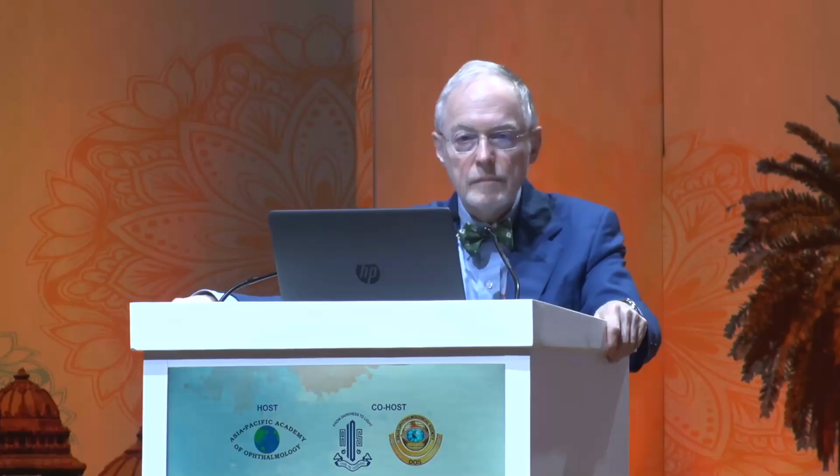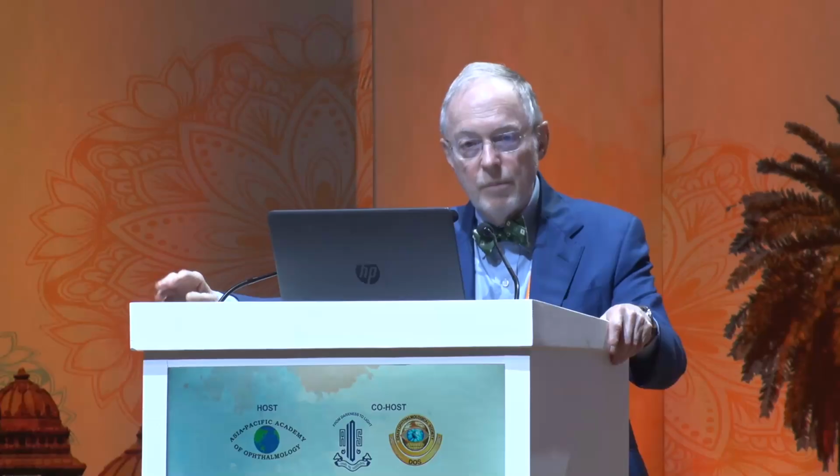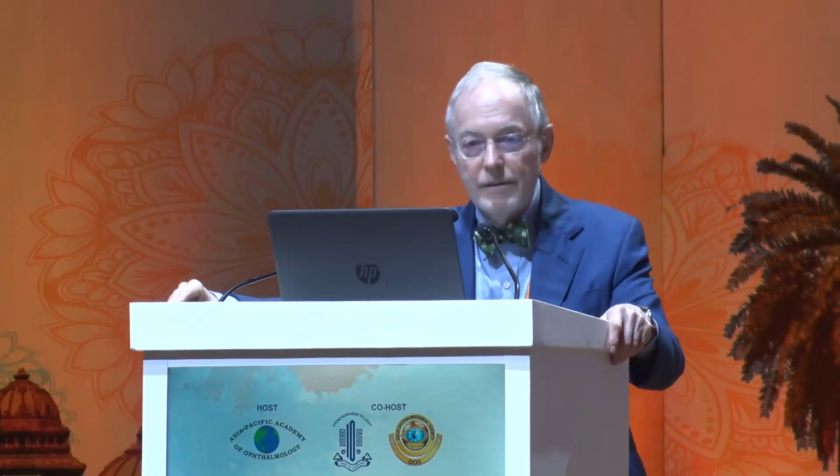What would be your recommendation for calculating IOL power post PRESBYOND LASIK? And it's a slightly hyperopic eye, or what kind of formula could be used? Post PRESBYOND LASIK, the blended laser vision correction, the ablation profile for PRESBYOND. Well, that's a version of a hyperopic LASIK, right? So I guess you would have to use your hyperopic LASIK formulas.